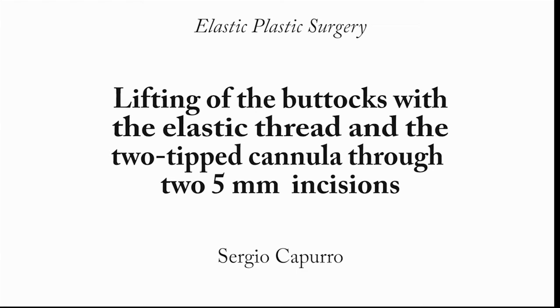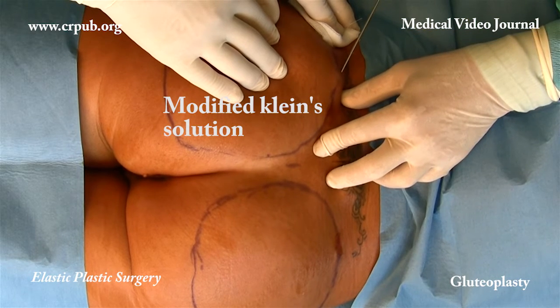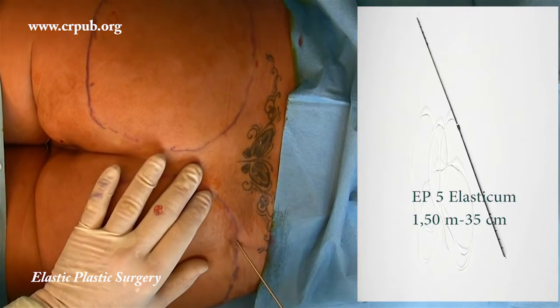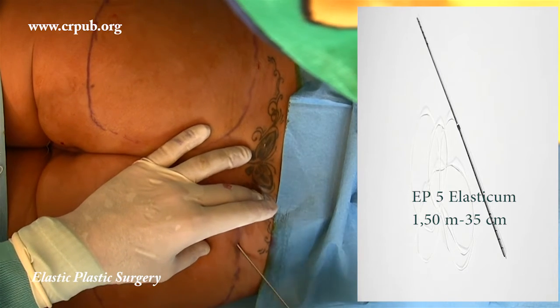Lifting of the buttocks with the elastic thread and the two-tipped cannula through two 5mm incisions. Elastic lifting of the buttocks is achieved by raising and compacting the subcutaneous tissues by means of the elastic thread. This thread does not cut into the tissues, is impalpable, and becomes integrated into the tissues.